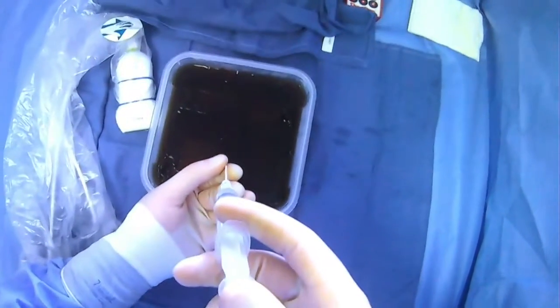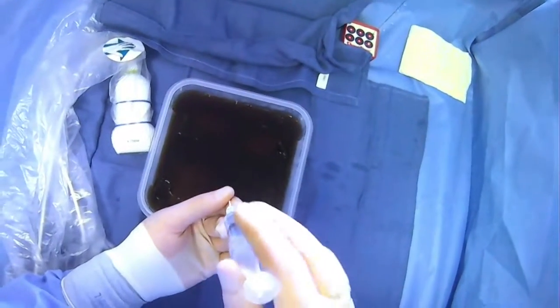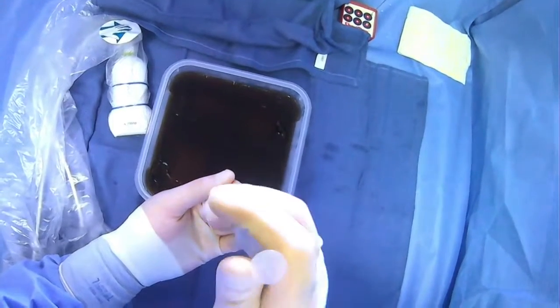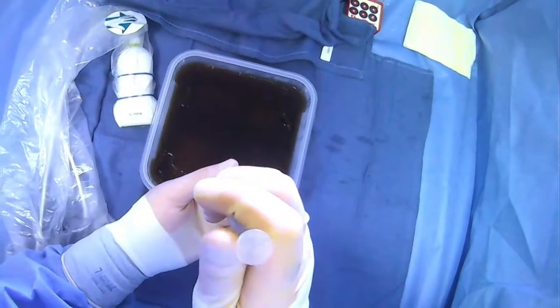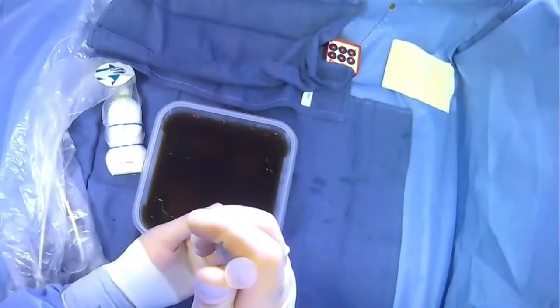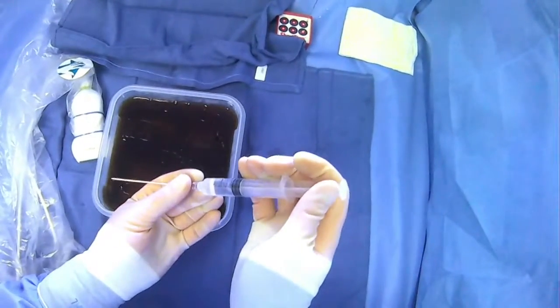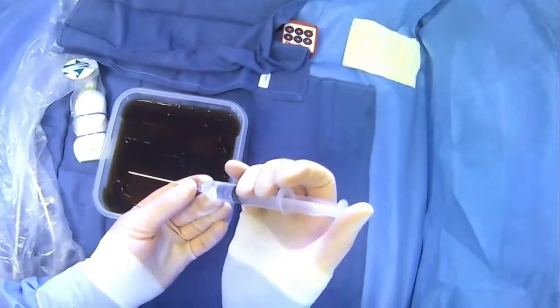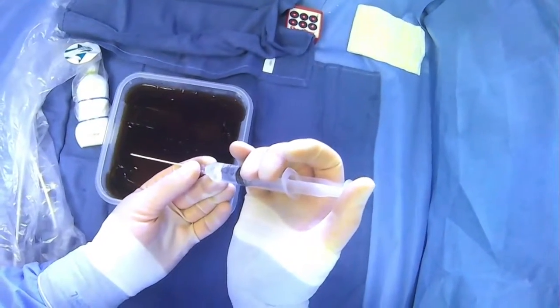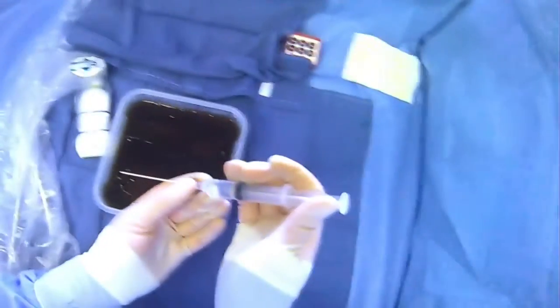Then advance with your desired trajectory and give lidocaine by depressing the plunger. As you advance, you'll also want to be comfortable pulling back the plunger to see if you aspirate any collection. You can hold your hands in a variety of positions — give lidocaine one way and switch to aspirate, or give lidocaine and bring your thumb down to aspirate. Do whatever is comfortable and works in your hands.